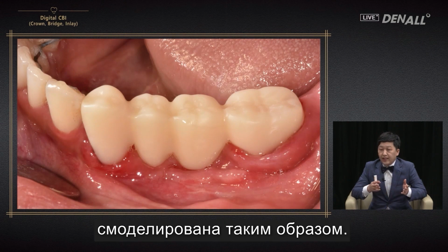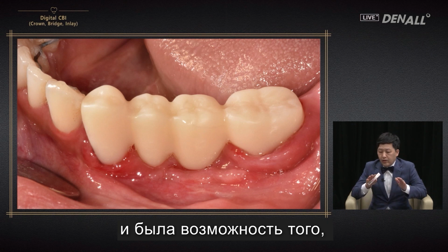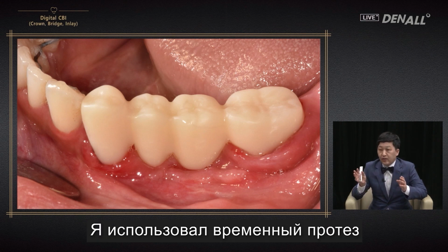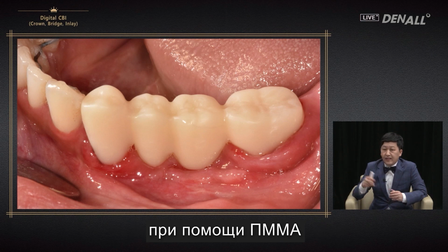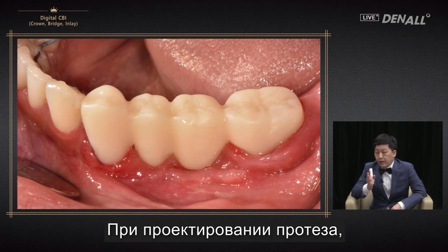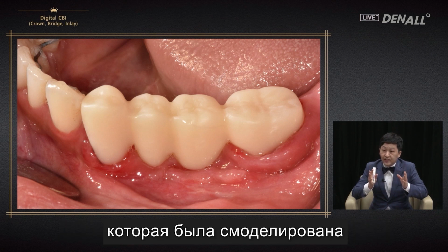Temporary crown has been designed like this. It was a long bridge. There was a possibility of occlusion being too high or low. I used temporary to check the design. I made temporary crown using PMMA, and I looked at it long and hard after setting it, but something didn't really quite click.